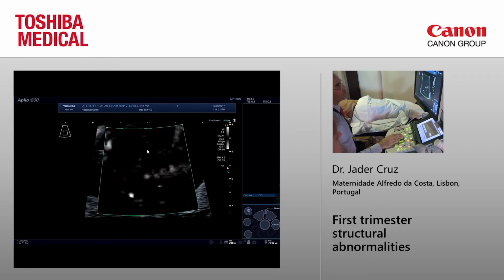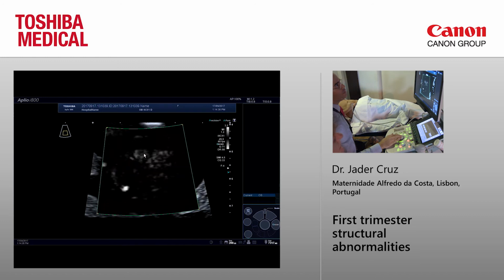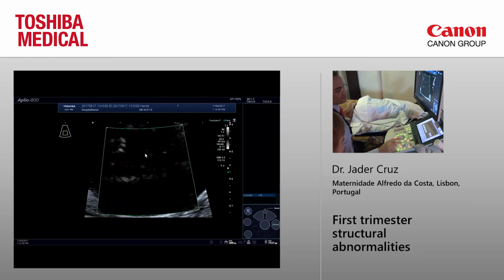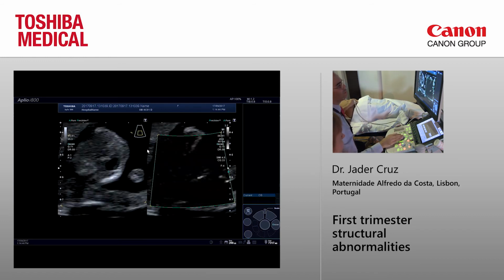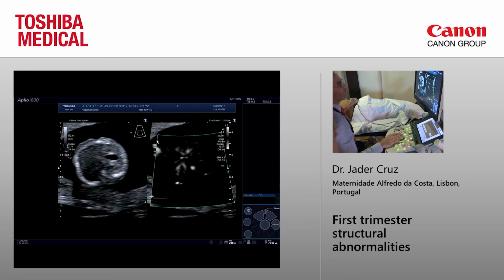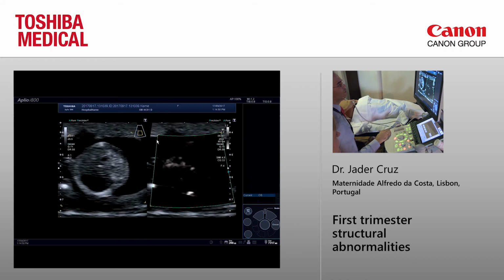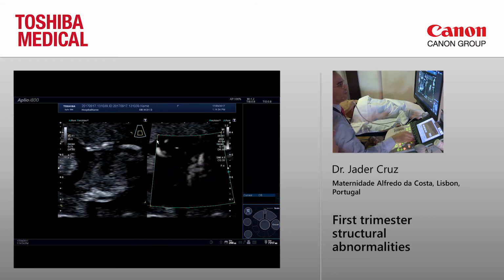You see the baby decided to go around. So you see the interventricular septum very well. Bye-bye, baby. Come back. Let me just have this. She's completely decided to let me down now. People are so friendly, they're just laughing at you. Baby, where are you now? What are you doing? It was very nice before. It was behaving very nicely.